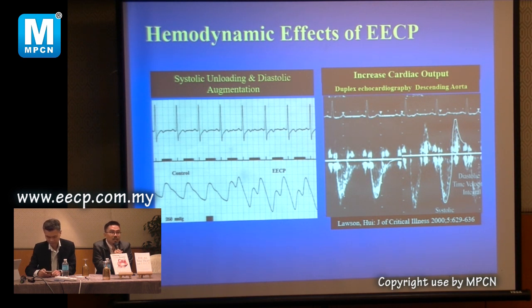Things as small as getting the correct wave, the optimal pressure, the skin preparation are all not taught, and I was told you just switch on the machine, start, and let it run. That is a very unprofessional way of doing things. I hope you all can bear this in mind.